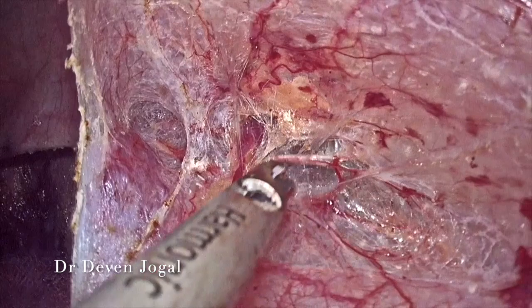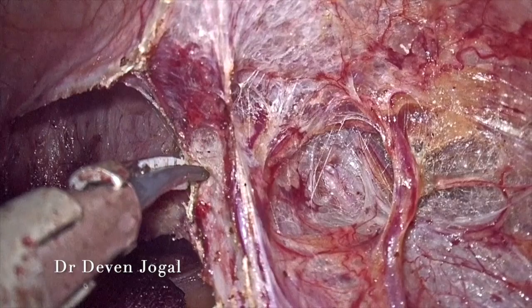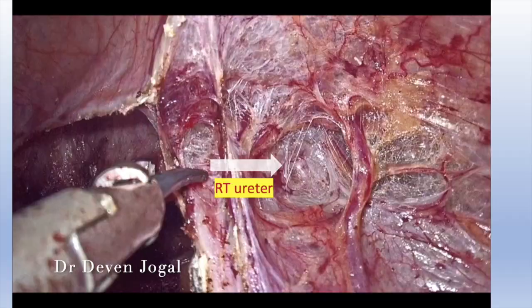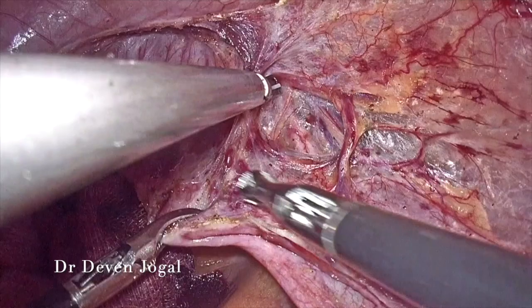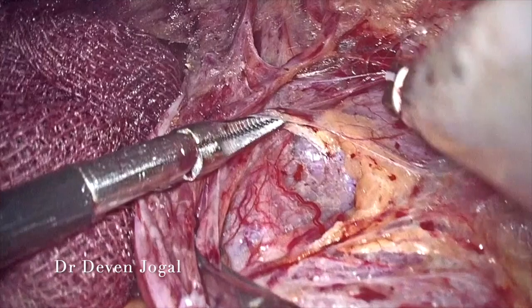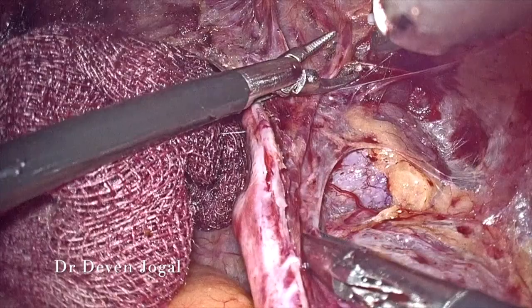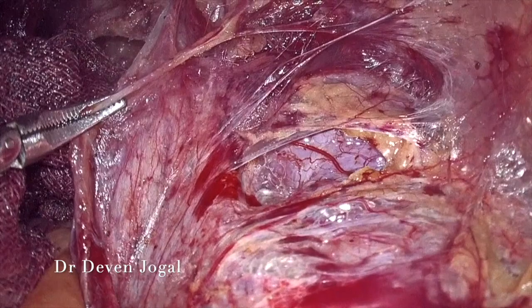This vessel was most likely the remnant of the uterine vessel, as it was supplying the remnant of the uterine bulb. This is the right ureter and you can appreciate the peristalsis of the right ureter here. After opening the retroperitoneum, you can see the outline of the right ectopic pelvic kidney, and this is the remnant of the right uterine artery.